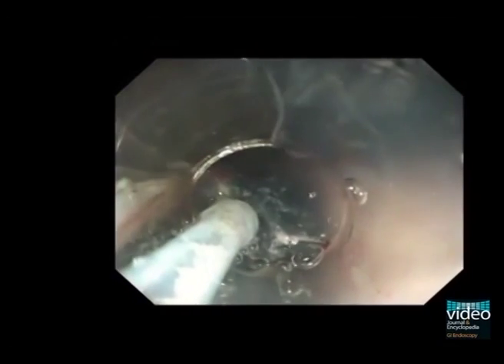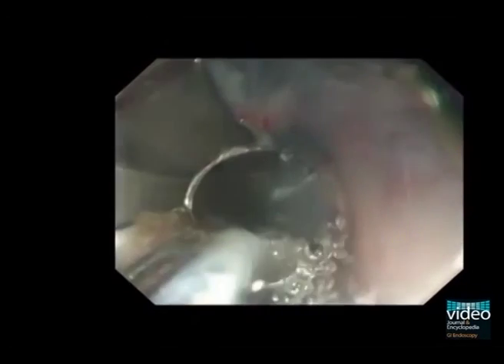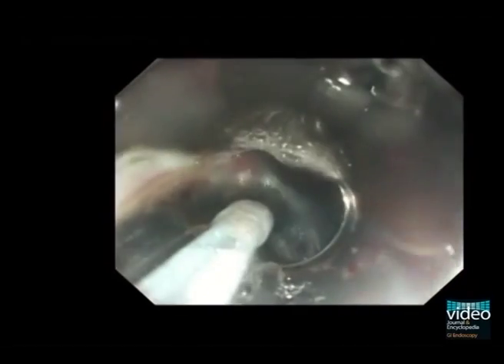The submucosal dissection proceeds. We can see the muscular layer on the right-hand side. Using a water jet system, a clear field can be obtained during the submucosal dissection.